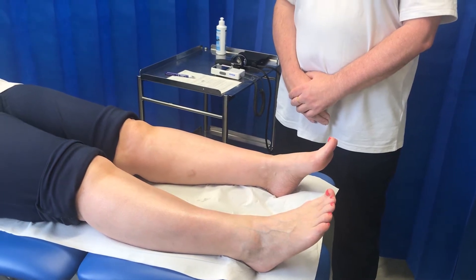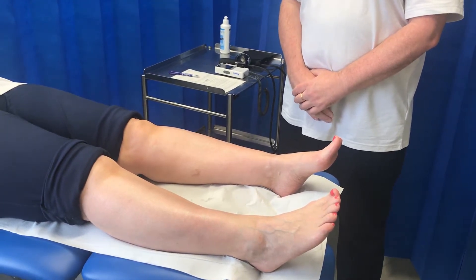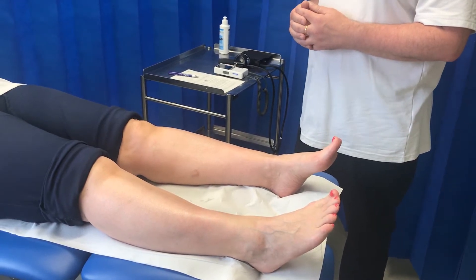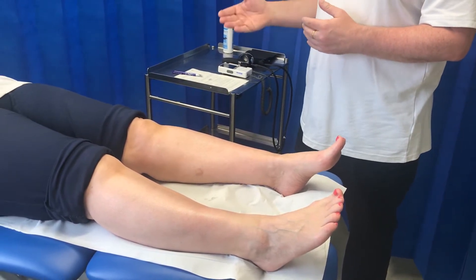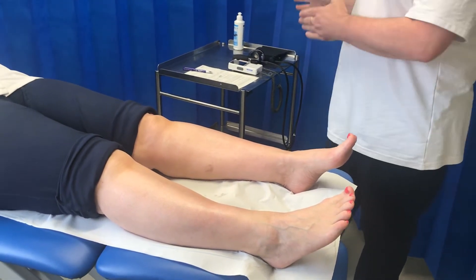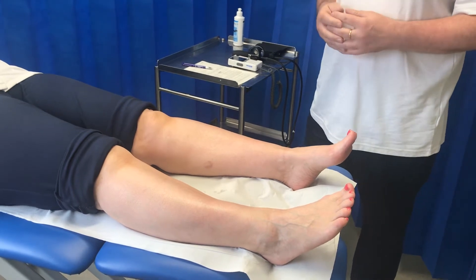I'm going to perform an ankle brachial pressure index test. We'll assume we've rested the patient for 10 minutes prior to starting. During that time we may have taken a history, looked at the limbs, and palpated pulses. I'll now go through the procedure of doing it, which should take less than about 10 minutes.